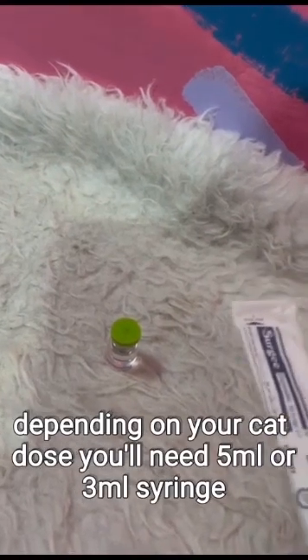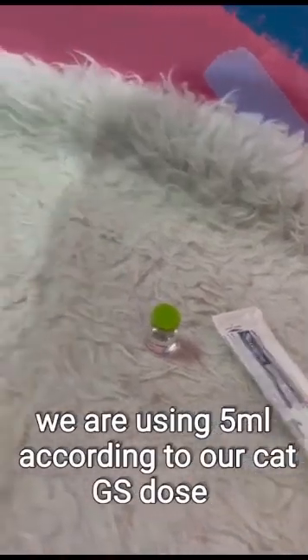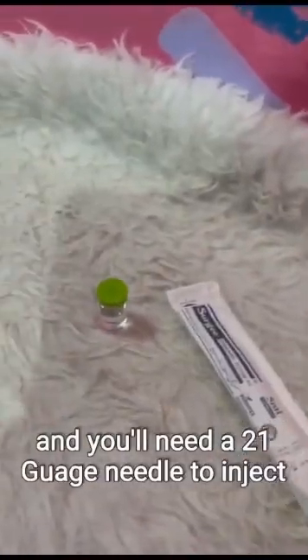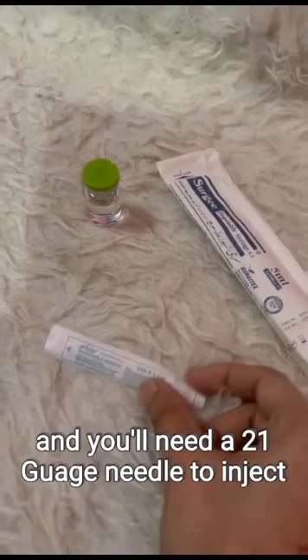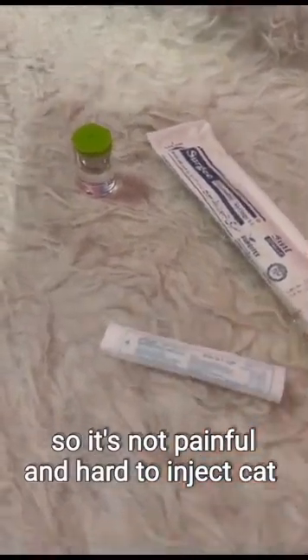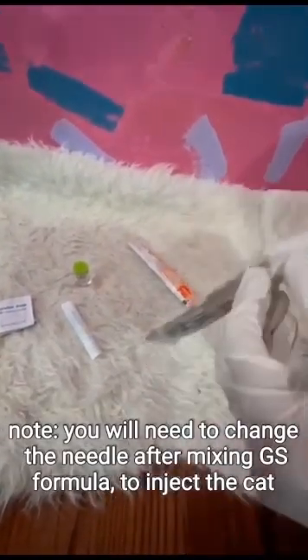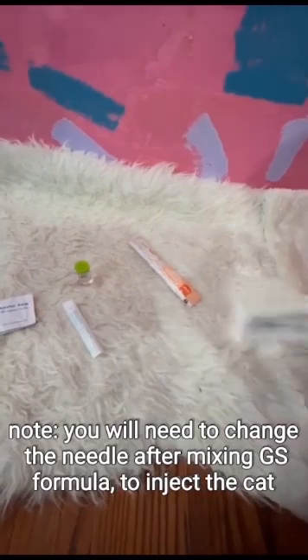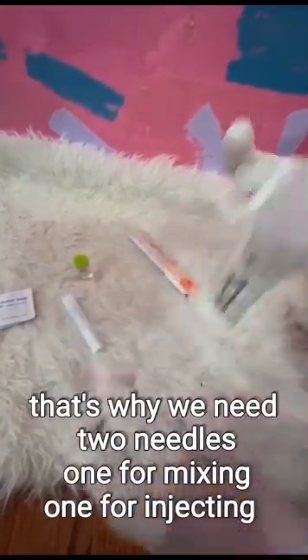Depending on your cat's dose, you'll need a 5 ml or 3 ml syringe. We're using 5 ml according to our cat's GS dose. You'll need a 21-gauge needle to inject, so it's not painful and hard to inject the cat. Note: you'll need to change the needle after mixing the GS formula to inject the cat. That is why we need two needles — one for mixing, one for injecting.